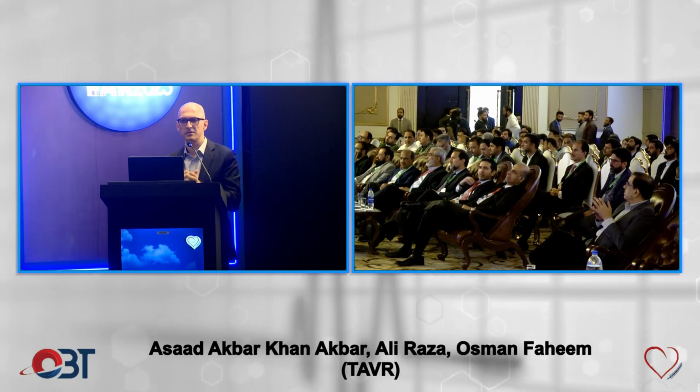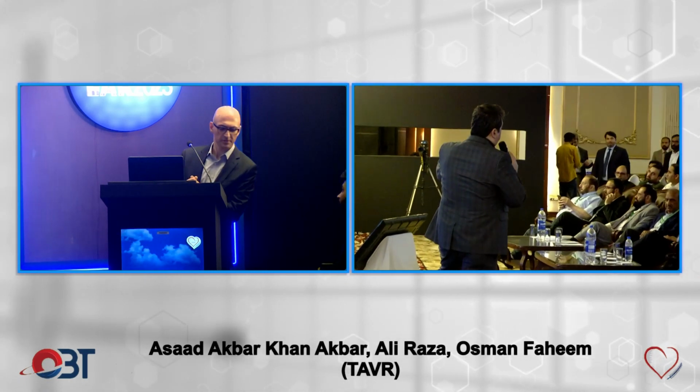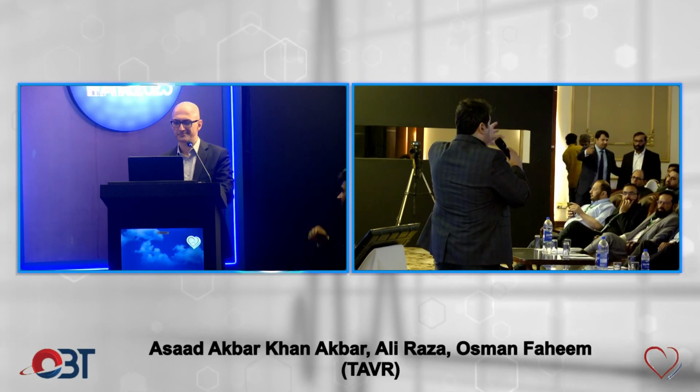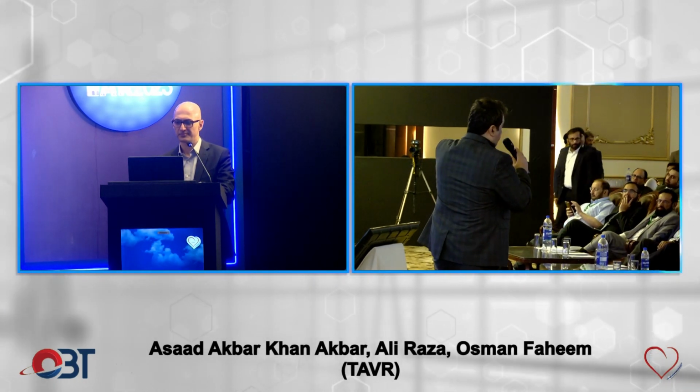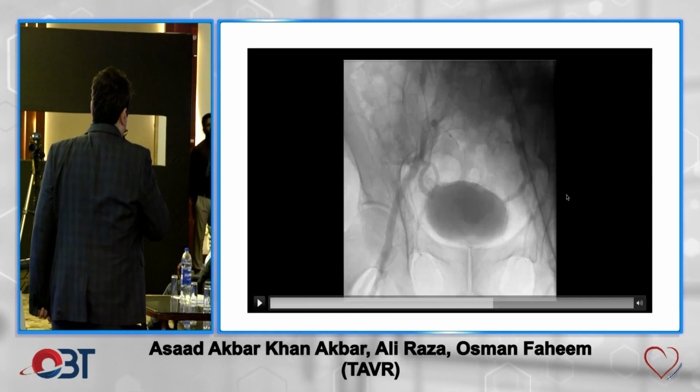We use a Confida because it's easily available. Yeah, Confida is easily available. Other stiff wire, I only use it if the aorta is a bit out of shape and I want to bring it into the shape. Yes, it's cumbersome. Make it easy for yourself and use Confida probably at the moment.